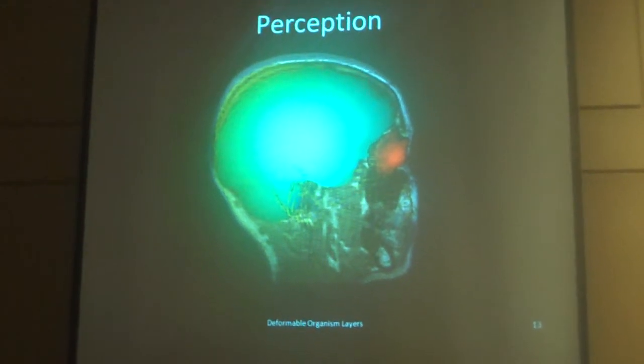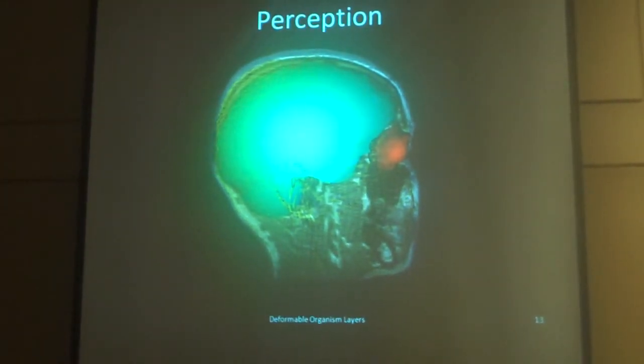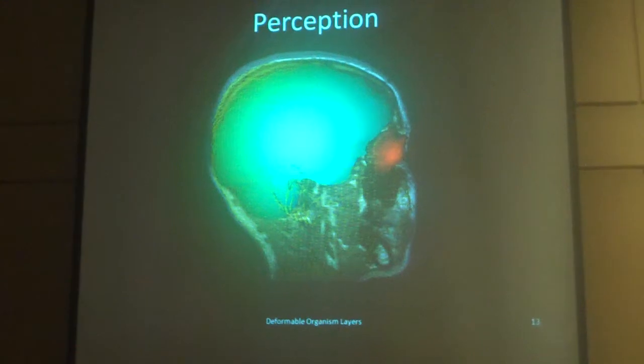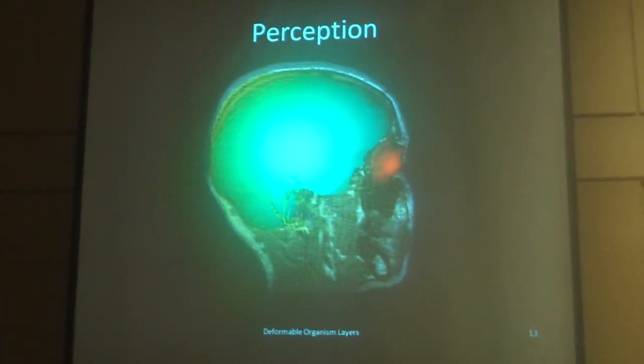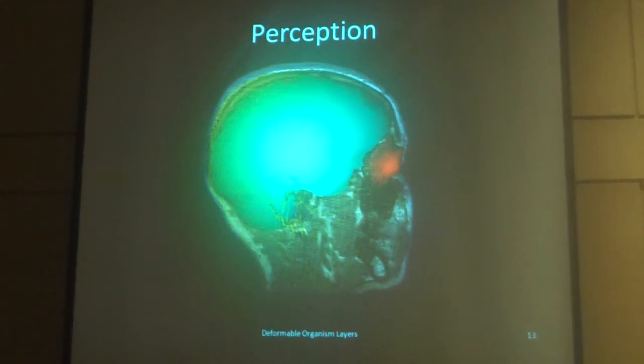Our organisms are embedded in the image space. Because of this, we can sample at the vertices of the mesh using nearest neighbor interpolation from the original T1 magnetic resonance image, the gradient image, the 2 or 3 means classification, or our threshold image.